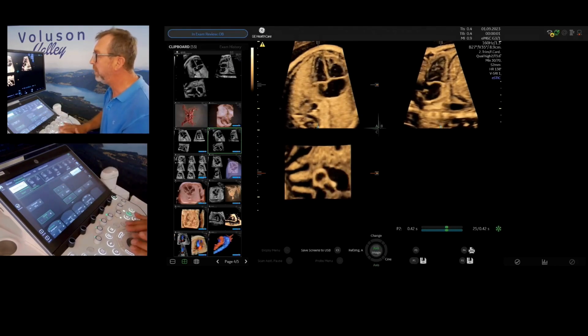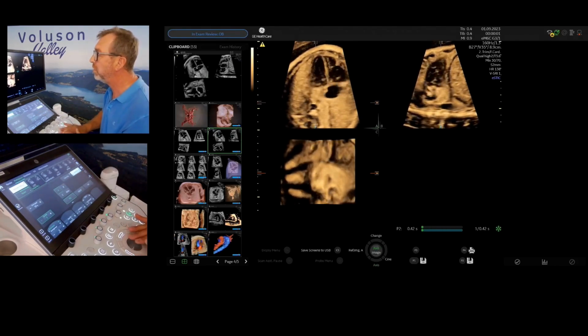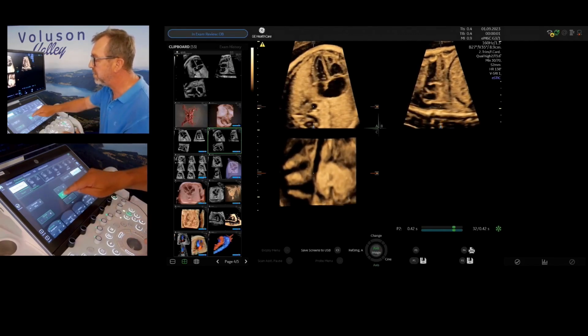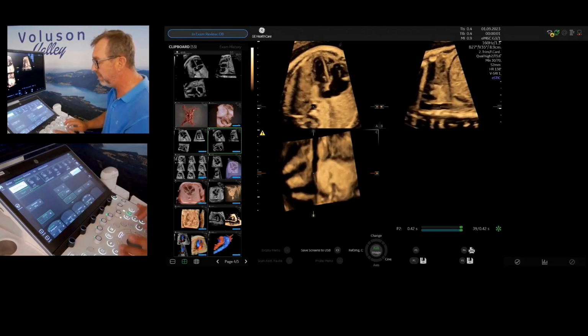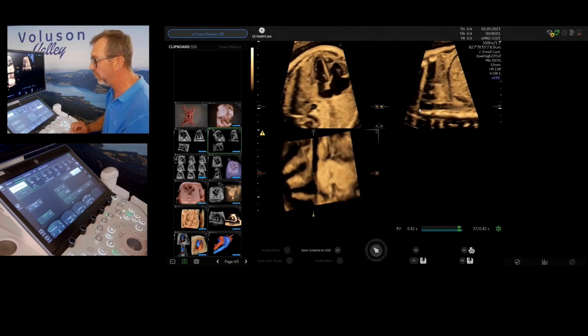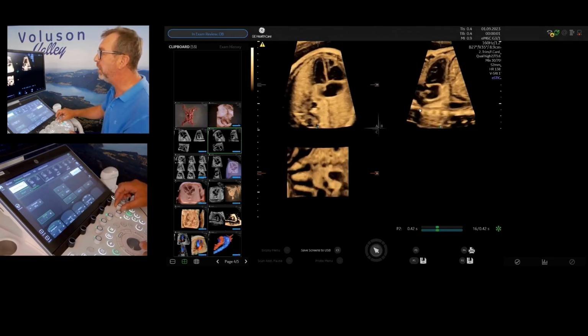In the A plane, we can see the cross section of the aorta. Place your dot into the aorta. Be sure in the C plane everything is vertically orientated. That means everything is absolutely vertical. The aorta is vertical, and in the B plane you can see then the aorta and the aorta coming out, the so-called aortic arch. Back to the init button on the beginning.